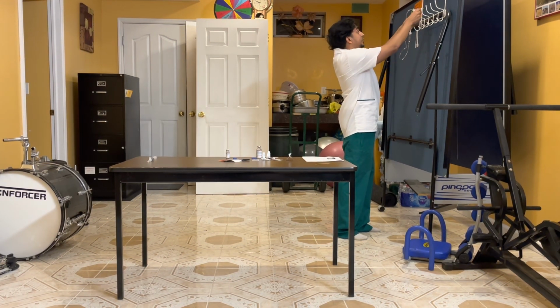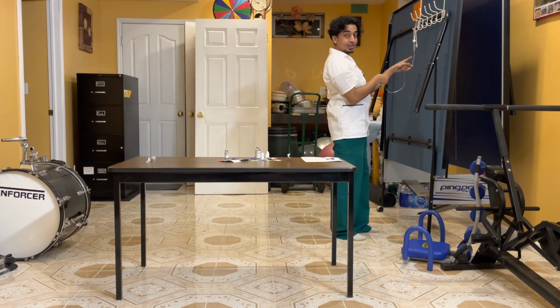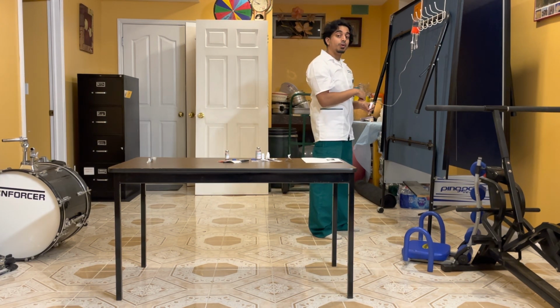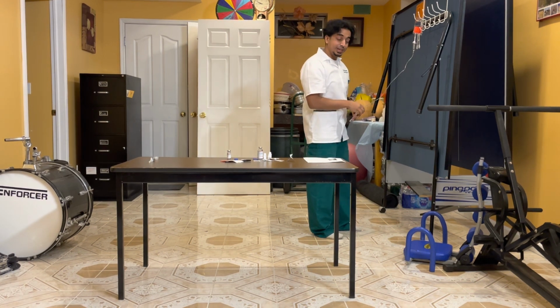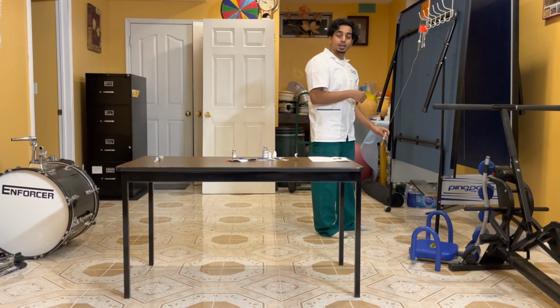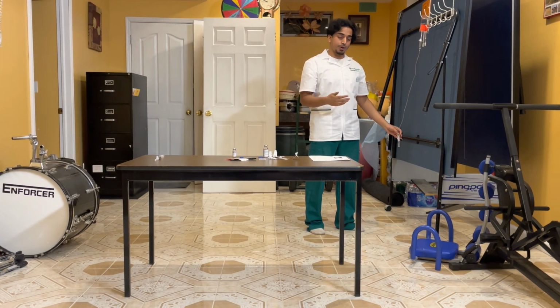I hang it higher than the regular IV bag, which is right here, so I put it higher. And I connect this tube port into the upper Y port of the normal IV line. Okay, now that I've inserted into the tube, I check the infusion rate. I check the rate, which is 100 milliliters per hour.